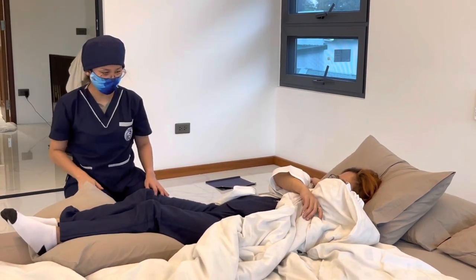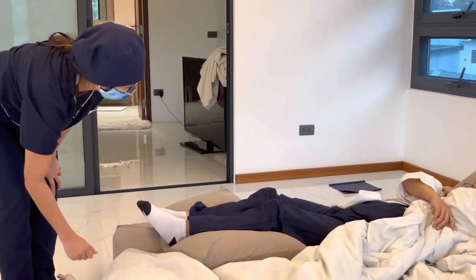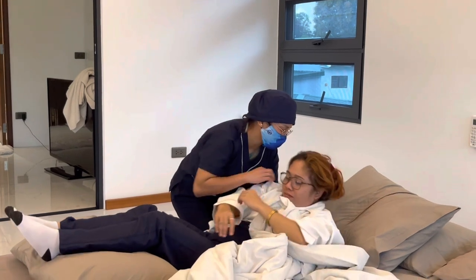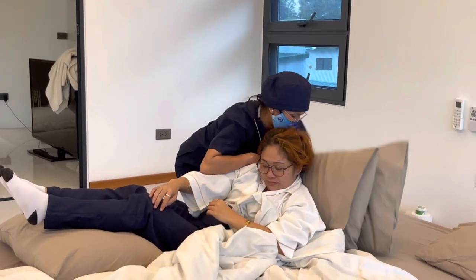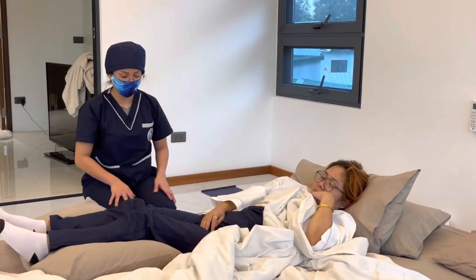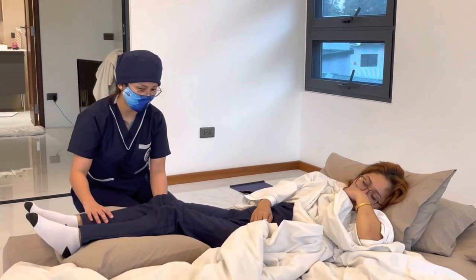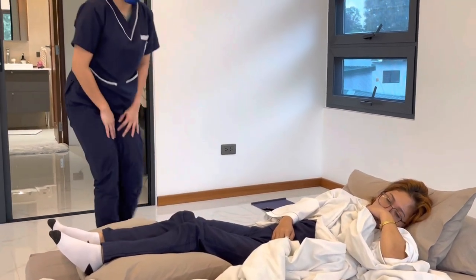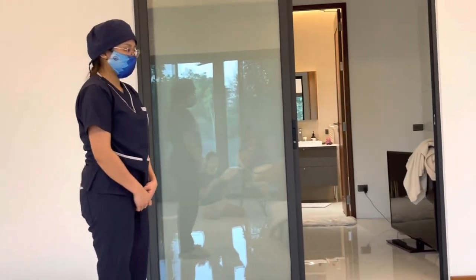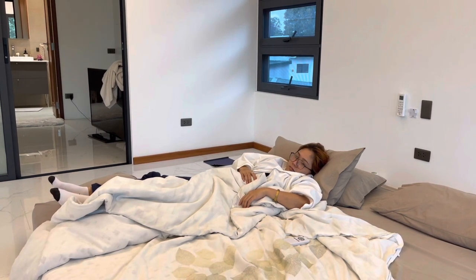Elevate the head of the bed to mid or high Fowler's position, if this is not contraindicated, as the patient grasps the side rails. Rationale: provide a position that approximates what is normal for elimination. Place the toilet tissue and call bell within the patient's reach and leave the patient. Rationale: emphasize privacy during elimination. Removing the bedpan: after giving the bedpan to the patient, we are now going to remove the bedpan.